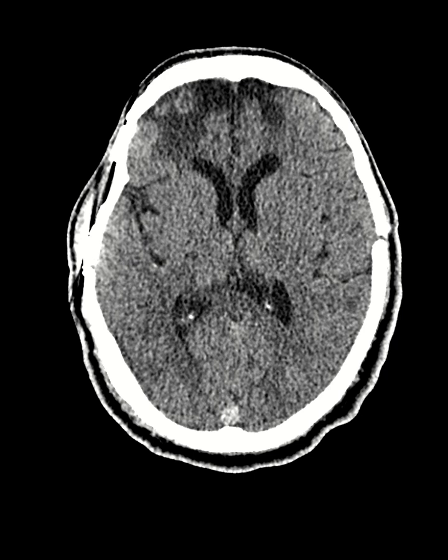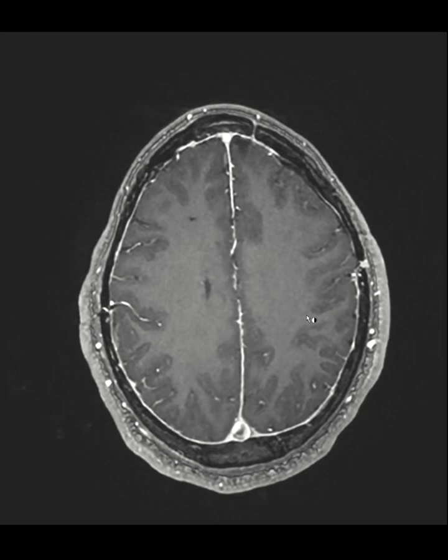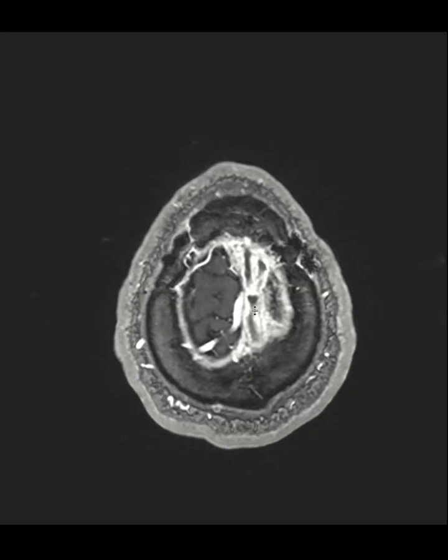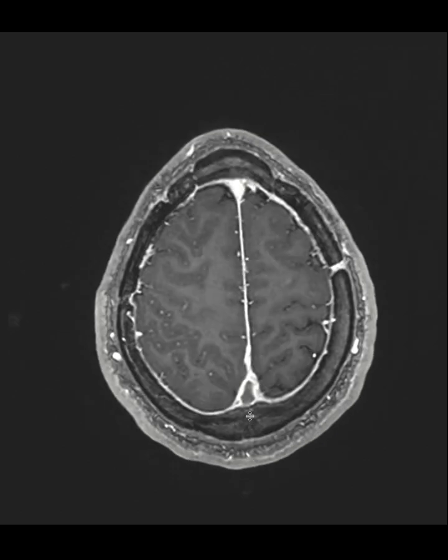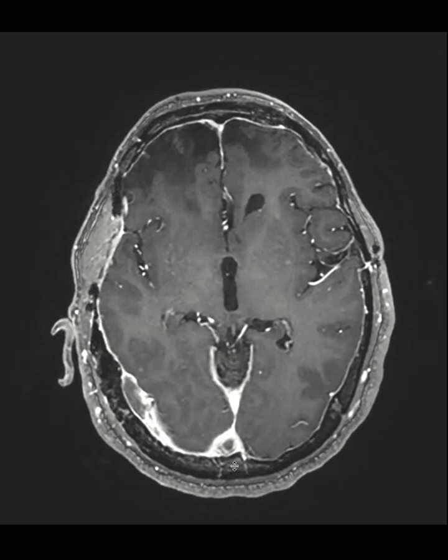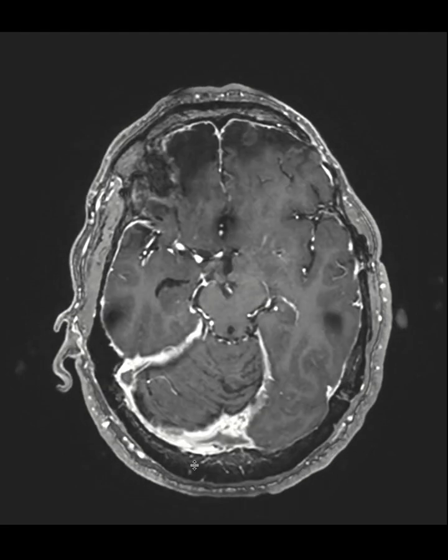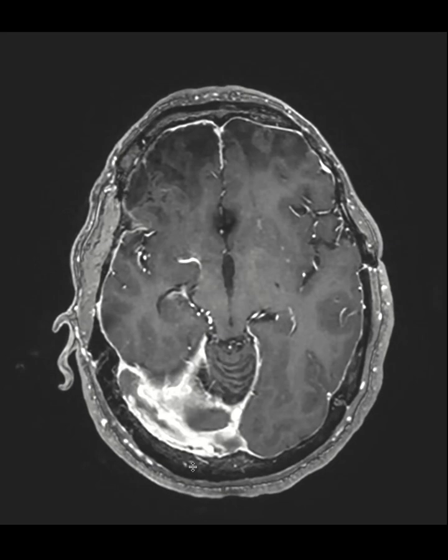If I want to show you how it looks on MRI — this patient has a post-contrast study. When you just follow the superior sagittal sinus, you see that all the way the superior sagittal sinus is just filled with thrombosis. And when you go down, you see that it's all involving the right transverse sinus. All these filling defects are venous sinus thrombosis — a very important diagnosis we shouldn't miss at all.